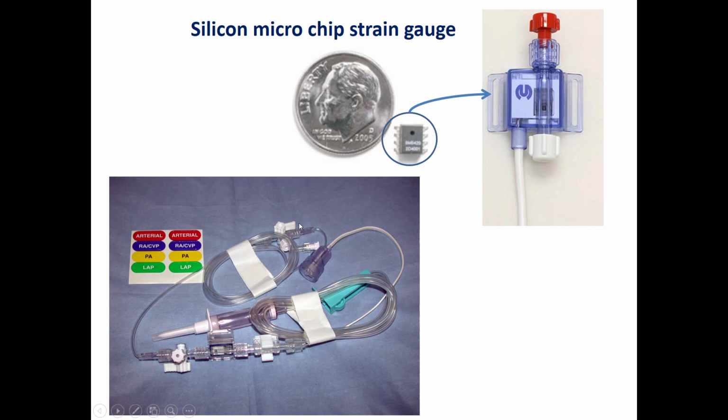As we said before, we have a catheter which is inserted inside the blood vessel. Then this is connected to this part here. This is the line which we need to model, which transmits the blood pressure wave to this catheter. However, we shouldn't have blood in this part, because if the blood is here, it's possible to have a clot, and this will prevent the transmission or the measurement of the pressure waveform.